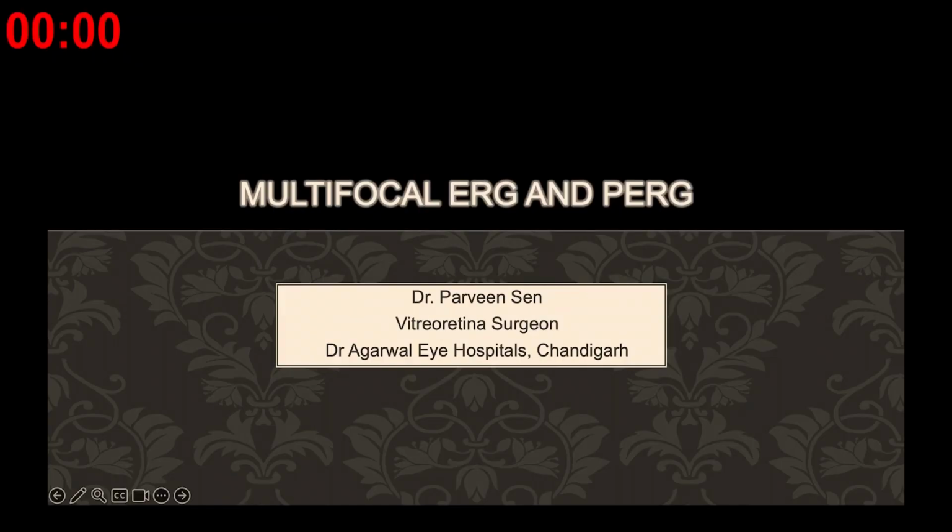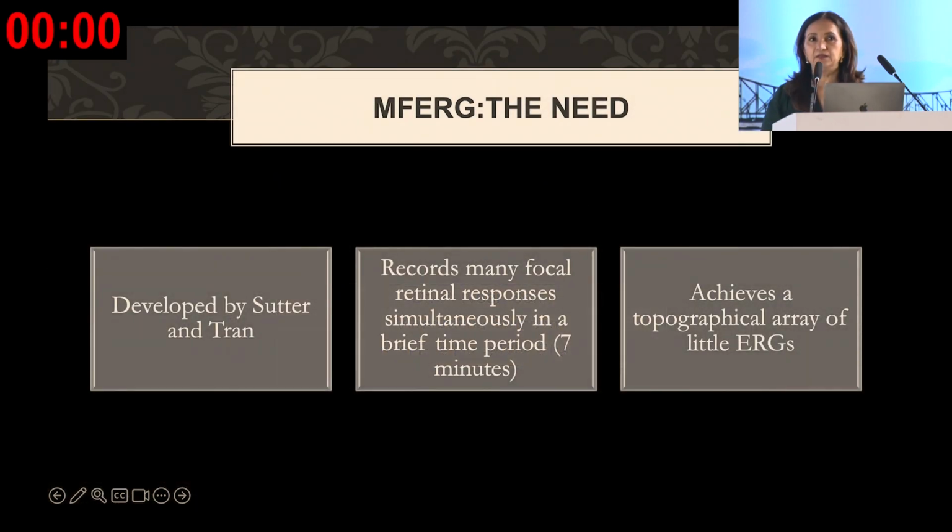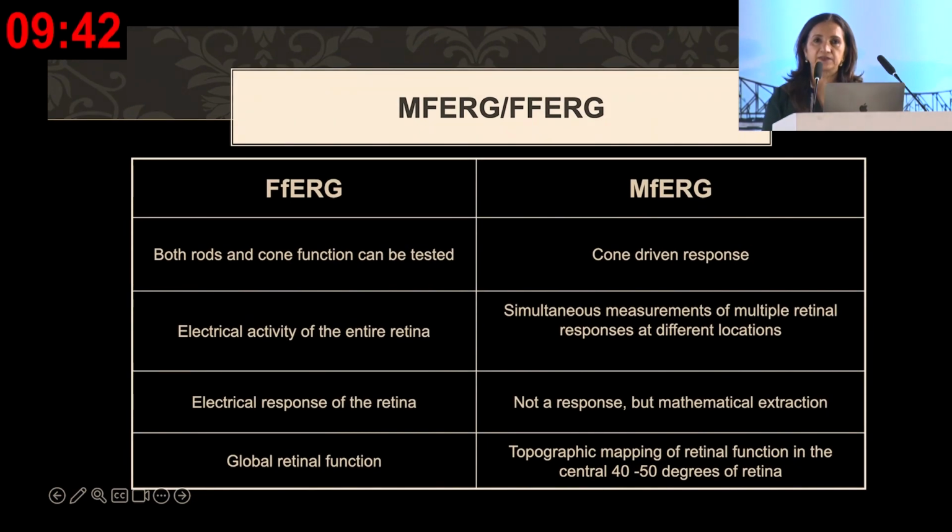And I'll take you away from full field ERG into another specific test, which is the multifocal ERG and pattern ERG. So why do we need multifocal ERG? As we saw Dr. Purnachanda tell us such good cases that we had, that it gives you so much information, then what is the need for another test? So the reason we need it is that full field ERG is a global response, and sometimes a focal or smaller area, if it is affected, gets missed. And to address this, we have other investigations.